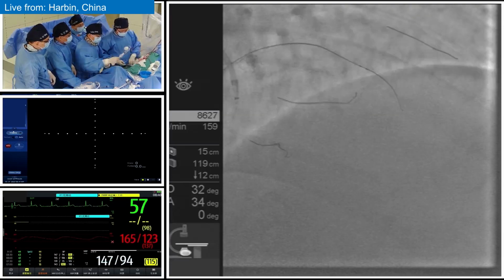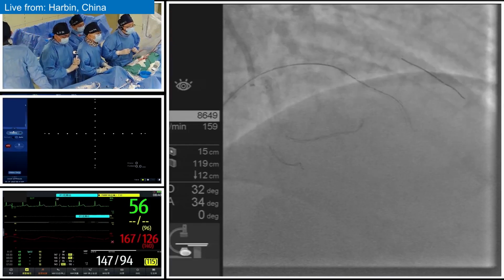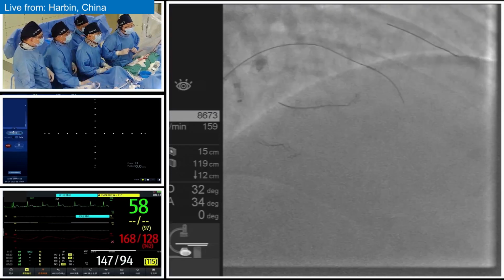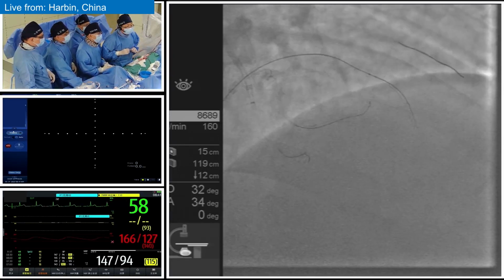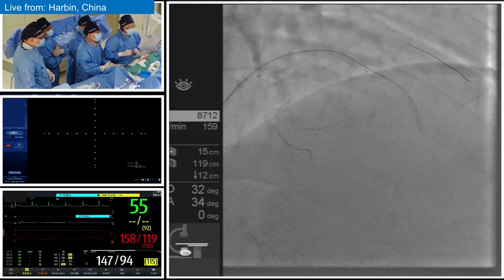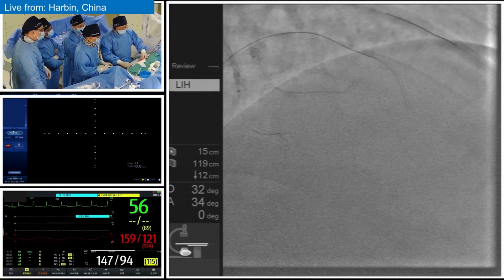I think one of the most difficult issues of this patient is that the collateral flow from the RCA is not sufficient to make a very clear identification of the distal true lumen. The wire should be in the subintimal space. The feeling tells me it's the subintimal space. So maybe it's a potential re-entry point. Test a little bit. Or maybe it's in the track from the attempt 3 months ago.